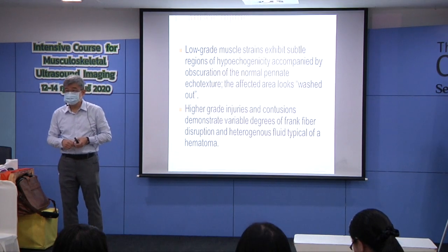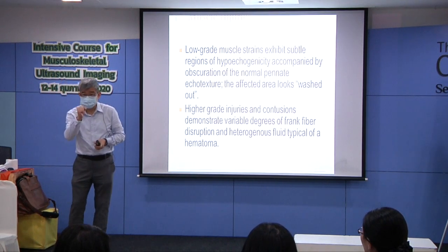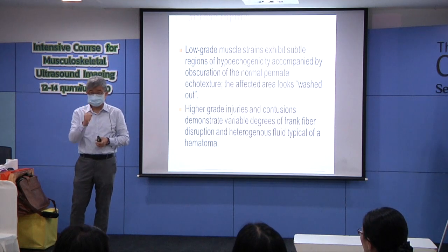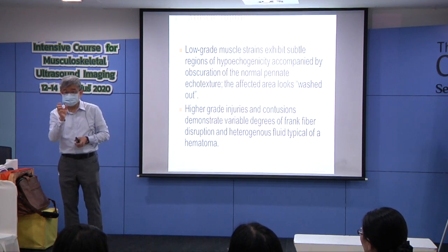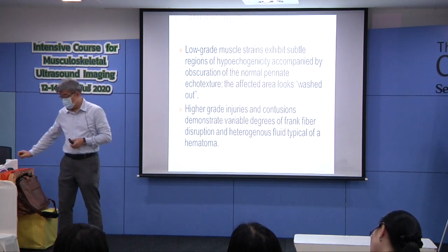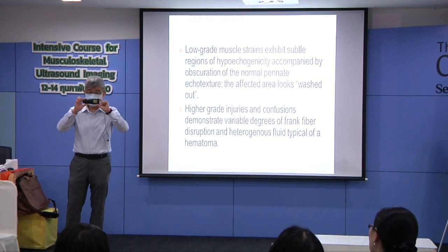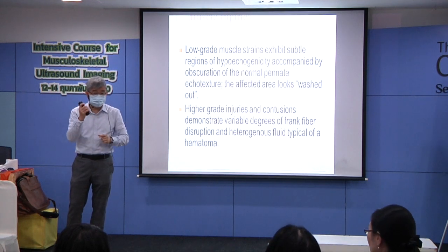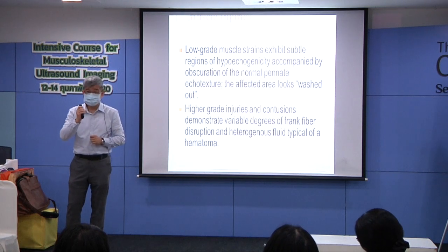as the source for the sound wave, not crystal. Crystal is very expensive. But the life of a semiconductor is slightly shorter, and they decay slightly quicker. So the semiconductor ultrasound is very good for a wireless probe. You do not use it very frequently, but for occasions. So they are very cheap.